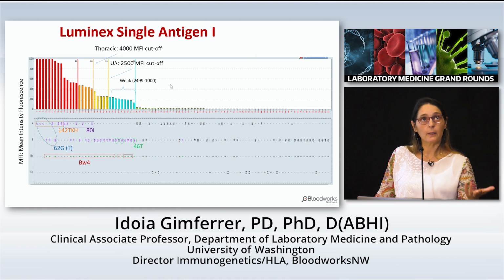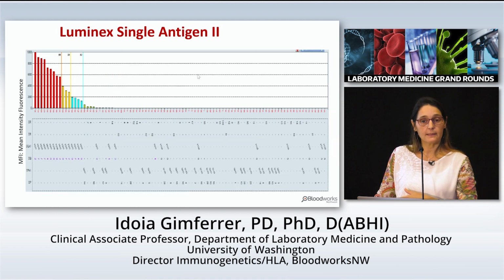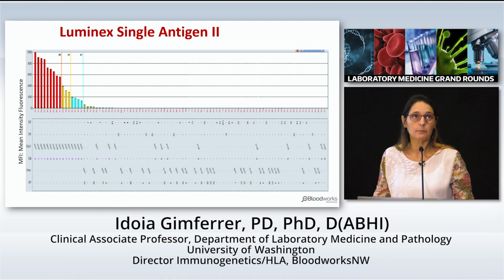So this is for a class 1, and then the class 2 analysis is similar. We have to do class 1 and class 2 separately because the kits are separate.